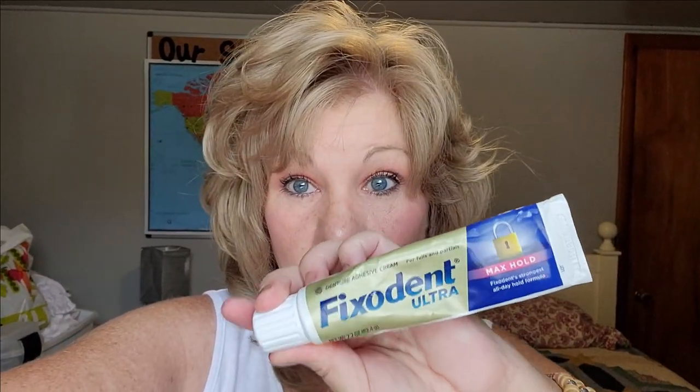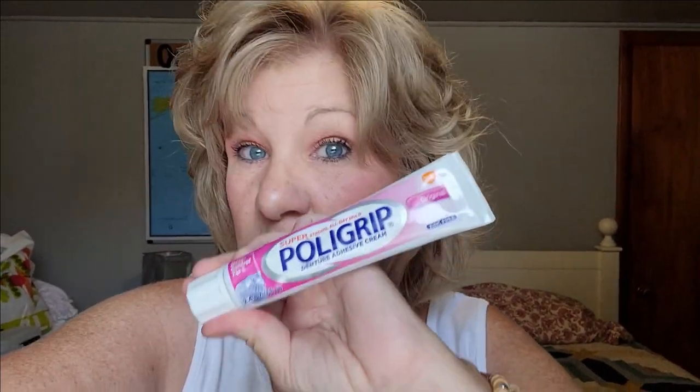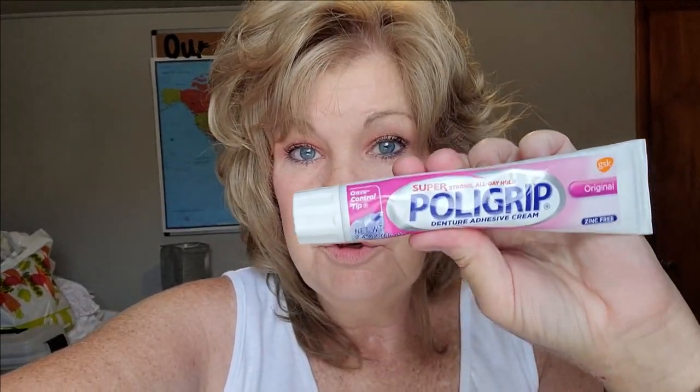If you want a long-lasting grip, use the Fix-A-Dent Ultra. If you need something just for short term, use the other one — that's the one I carry in my purse. I'll use the Ultra at home and then keep the other in my purse. If I need to re-secure, normally it's the bottom that comes loose, so I'll use that one. Neither one of them are bad — I just use them at different times.